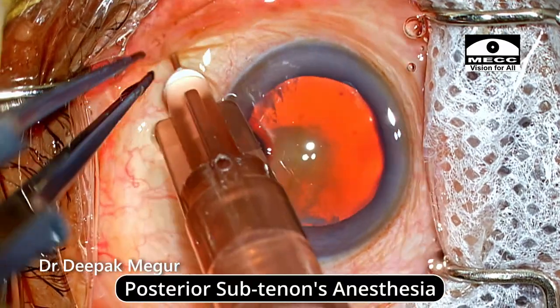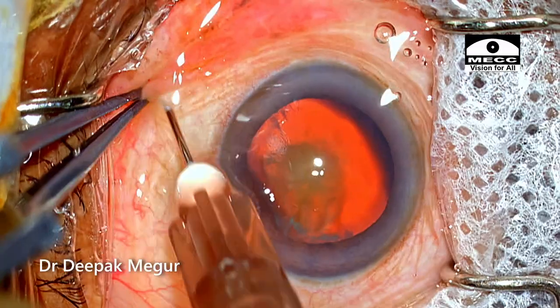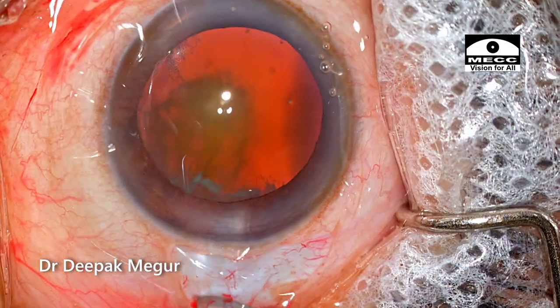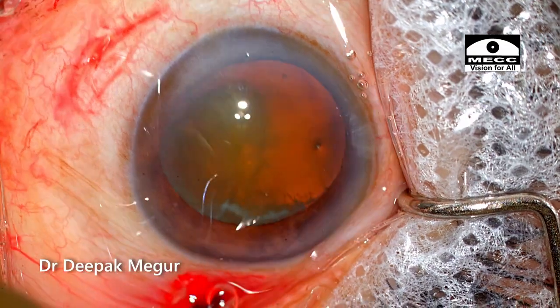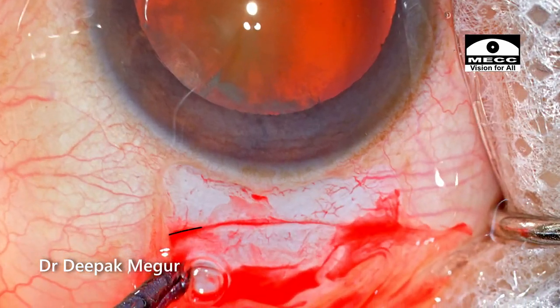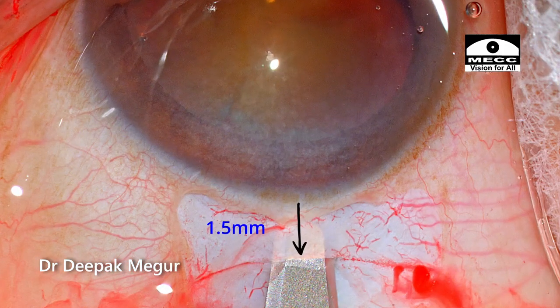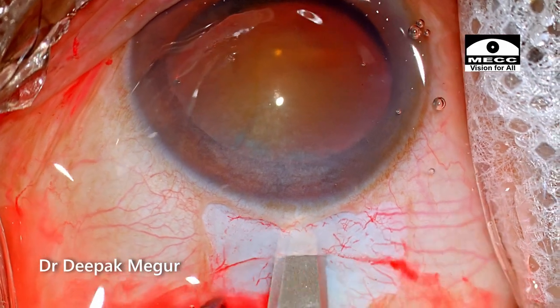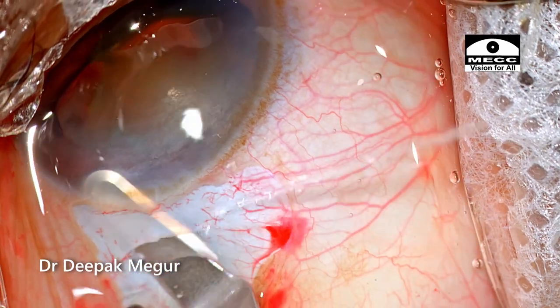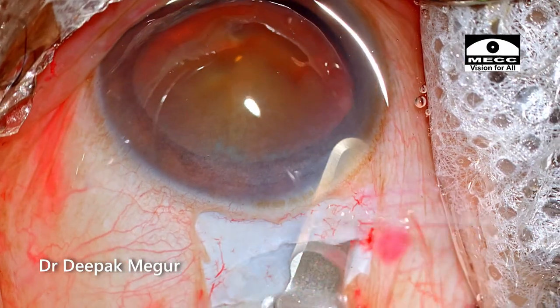The surgery is being done under sub-Tenon's anesthesia. I've given 1 ml of lignocaine in the sub-Tenon's injection in the inferomedial quadrant. The conjunctival flap is raised. My aim is to do a 6 mm sclerocorneal tunnel. I make an initial groove just to stabilize the globe, then fashion the external scleral incision and begin to tunnel. The external incision is slightly frown-shaped and the central part is around 1 to 1.5 mm posterior to the posterior limbus. The intracorneal tunneling is continued on either side and is at least 1.5 mm anterior to the posterior limbus, ensuring an adequate self-sealing valve. Just to remind you, this is a temporal incision.